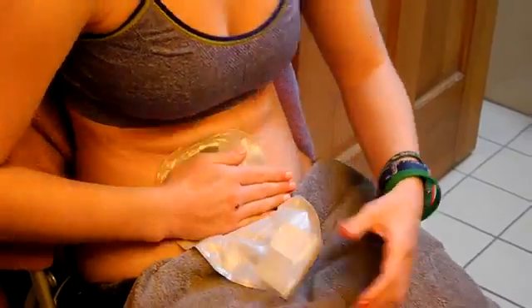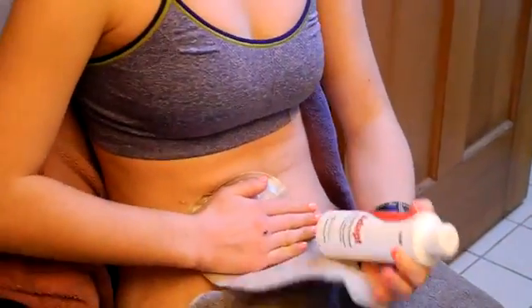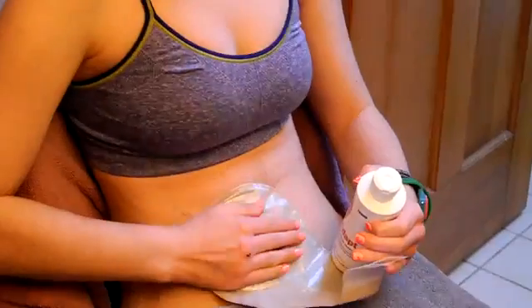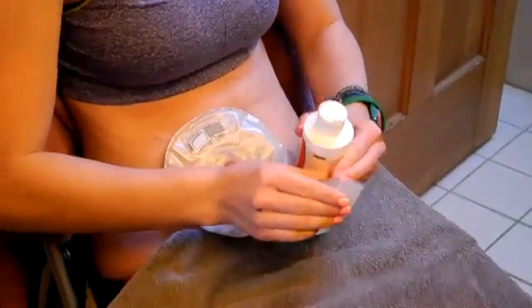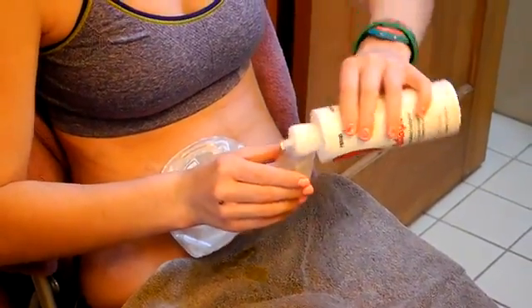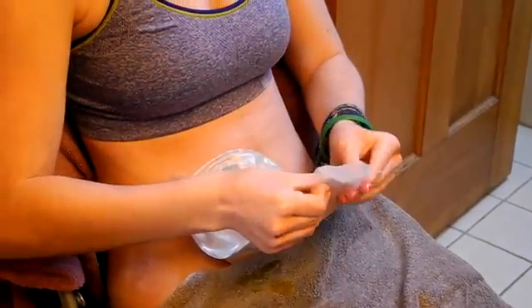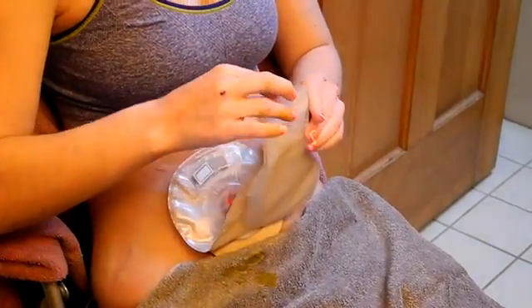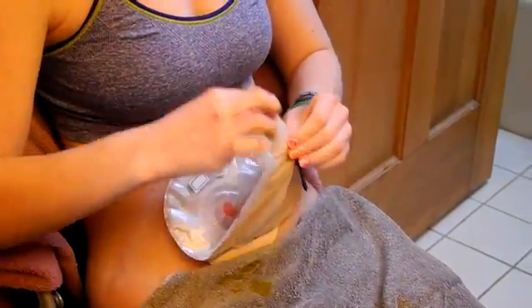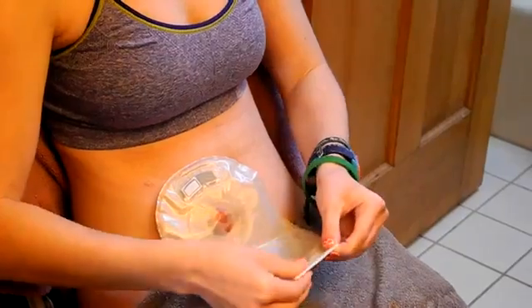And then I usually, here, let me go grab it really quick. Sorry, my drain is sticking out. I usually use just this lubricating deodorant. I usually put it in when I change it and sometimes when I empty it as well. It just helps for stool not to pancake onto your bag. So you just kind of put in what you think would be like a teaspoon worth and you close it up. Just let it drip in a little bit. Yeah, it did. Okay, so you just 1, 2, 3, and then you snap it.